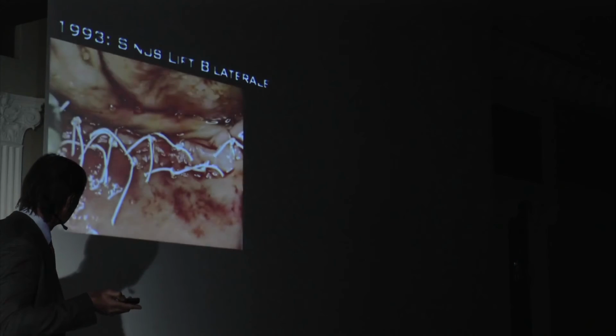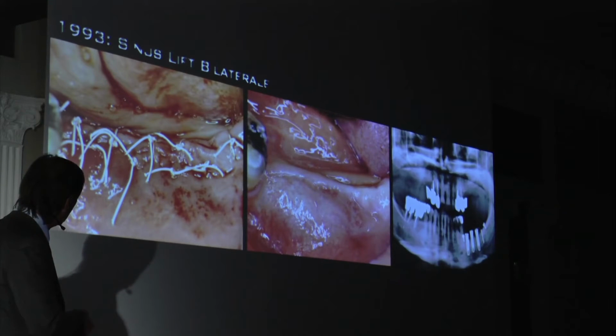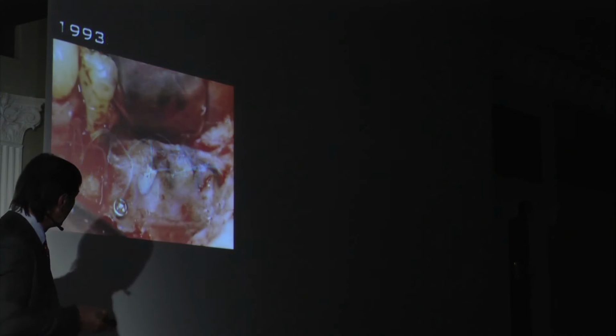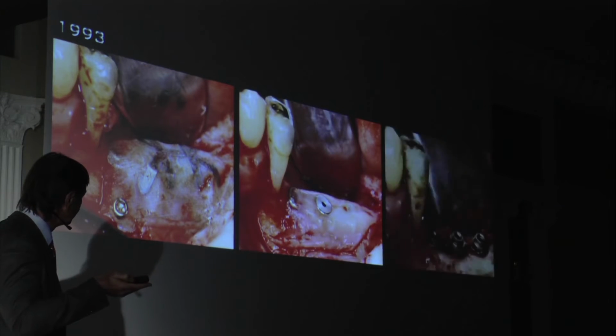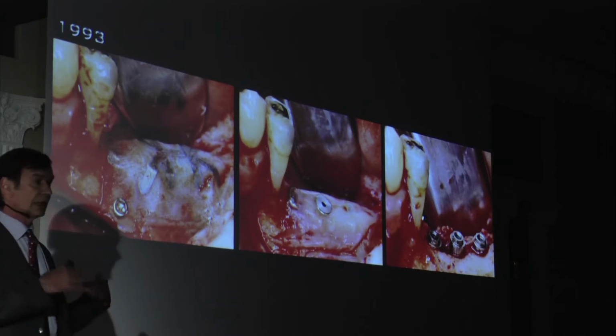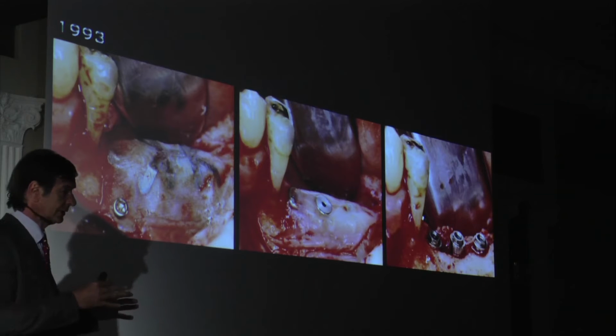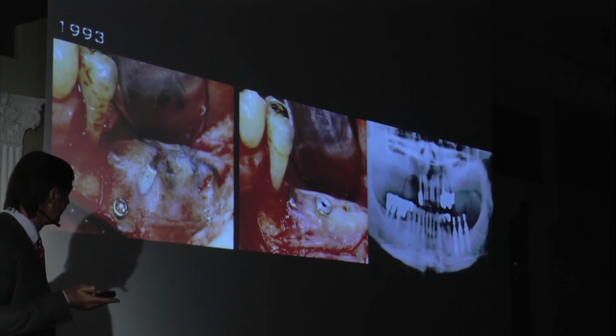I don't want to go too slowly. Nice healing, sinus lifts, and 1993, vertical augmentation. The result, pretty nice. But you see that without a filling material, without any bone graft, the regeneration was not 100%, was partial. And we had the implant sticking out from the bone a little bit.